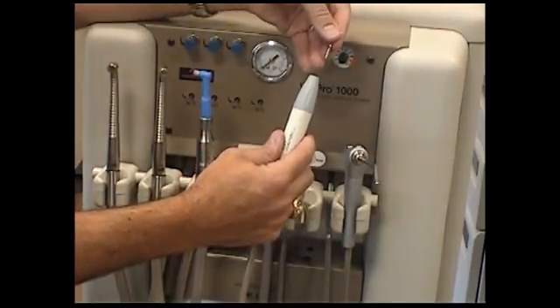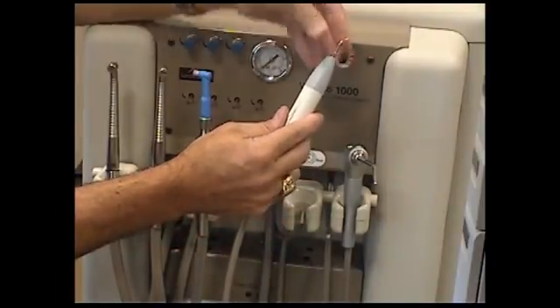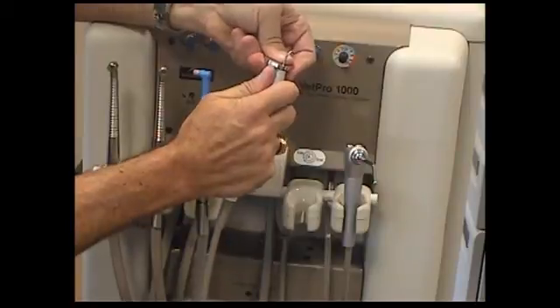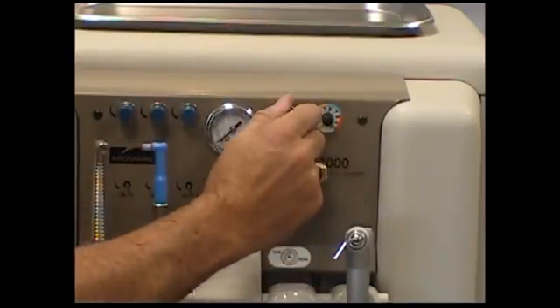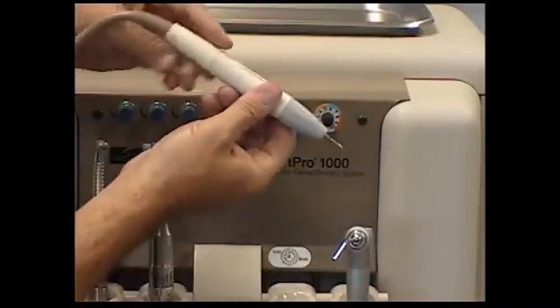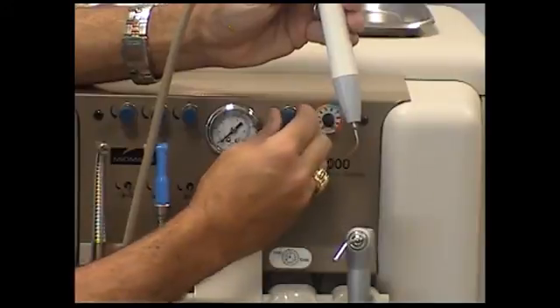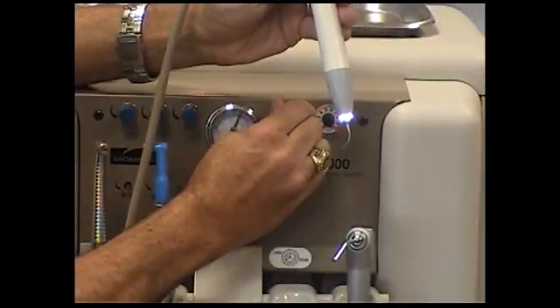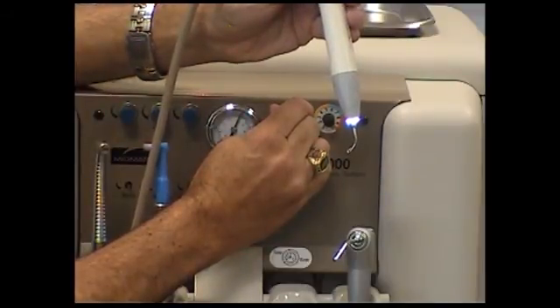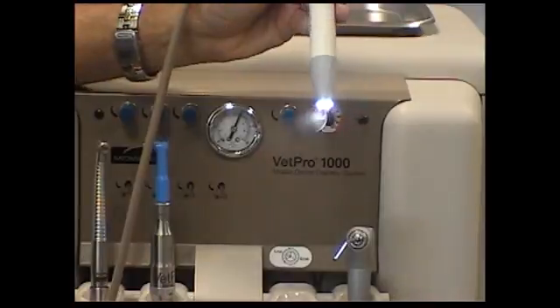Screw the scaler tip into the handle. Prior to use, tighten the tip using the key tool that's shaped like a stop sign. Turn the scaler needle valve off by turning the blue knob all the way to the right. Turn the scaler intensity knob all the way to the left. While fully depressing the foot control, turn the scaler needle valve knob to the left until droplets flow from the tip as shown. Next, turn the intensity knob to the color range appropriate for the tip. Your scaler is now ready for use.